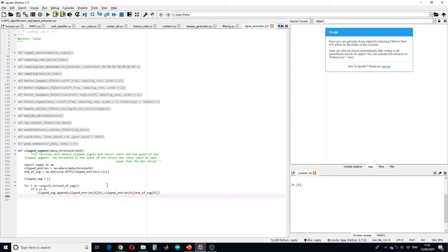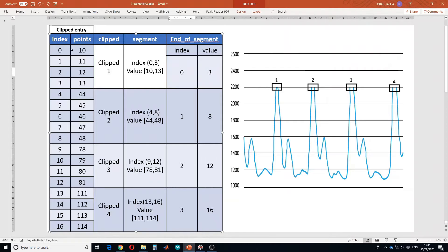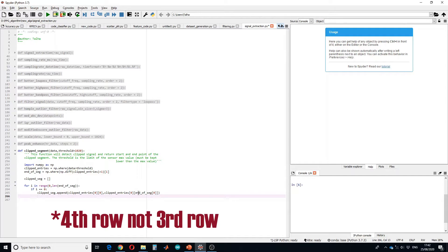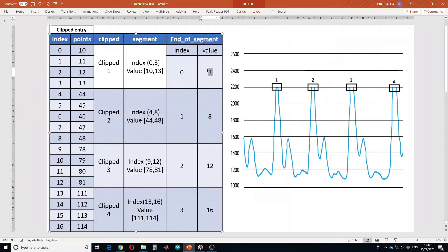The first segment entries will be recorded as follows: the start point will be clipped entry index [0,0], which is 10, and the end will be clipped entry first column at the third row, because the end-of-segment first entry is three. It will pick three from there, go to index three, and get 13. So we will have 10 and 13 in the first segment.